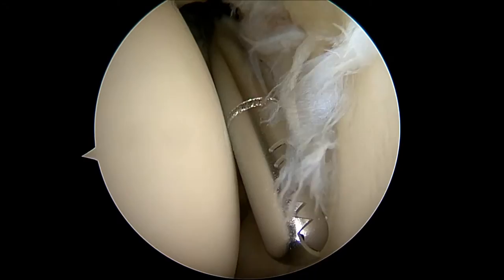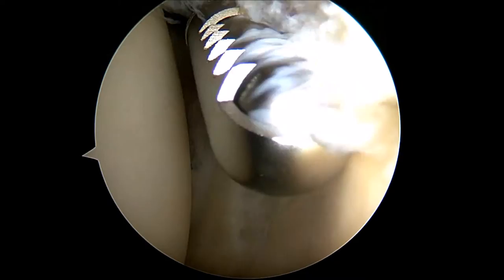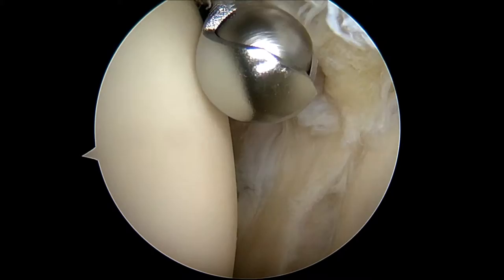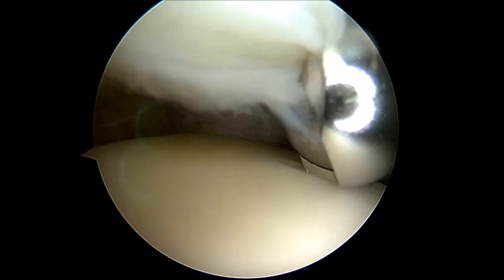An arthroscopic shaving device is inserted into the joint space to remove the frayed labral tissue. The humeral head is seen on the left, the glenoid is on the right, and the frayed labrum in the front and on top of the shoulder is cleaned up using the shaving device. The labrum on the top of the glenoid is removed. Attention is then taken towards the labrum in the front of the shoulder. The shaver device is then inserted to clean up the frayed rotator cuff tissue and the area of the supraspinatus rotator cuff tear.